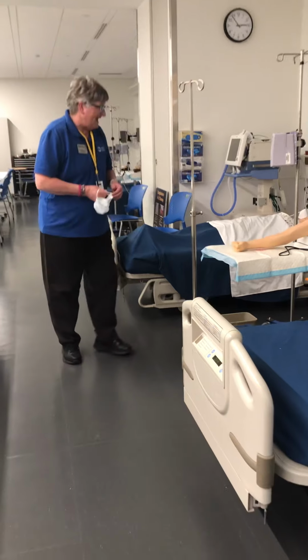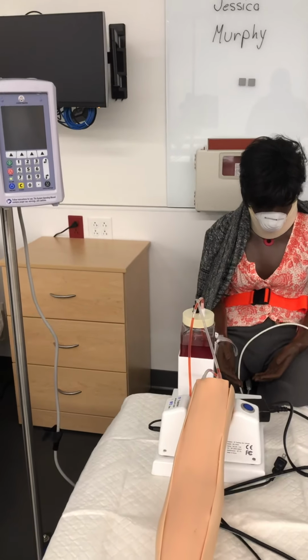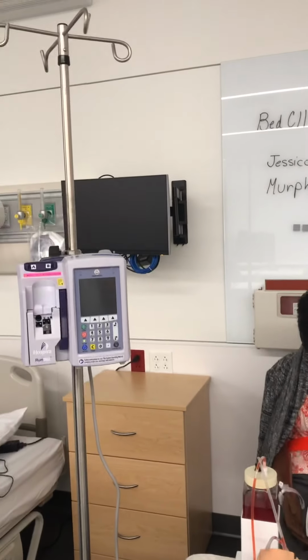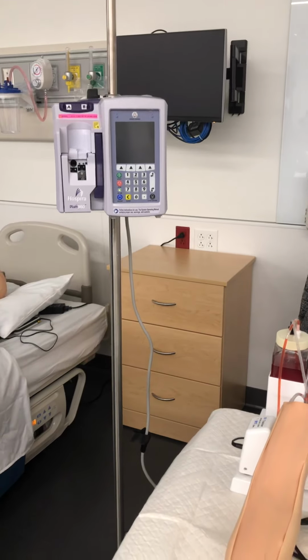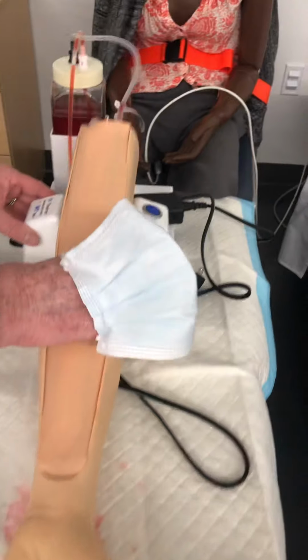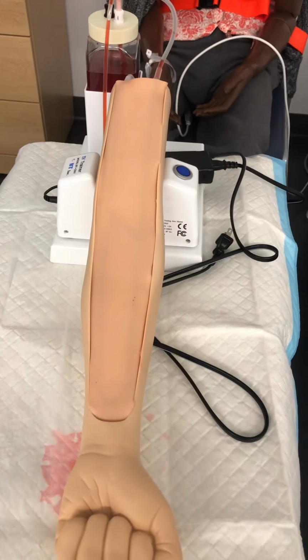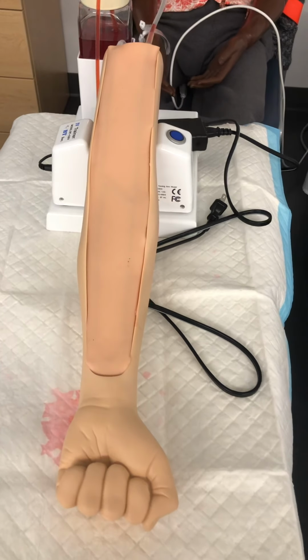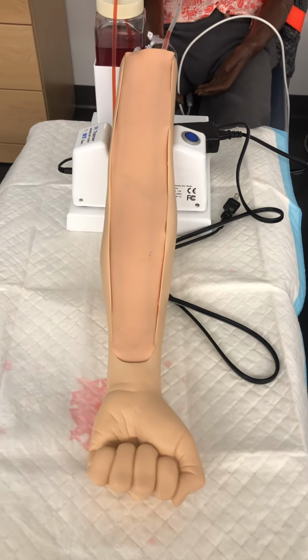The class right now is finishing up learning about how to start IVs and how to run fluids and medications into a patient by using an IV, an intravenous. So a needle goes into your vein, and then fluid can be administered, medication can be administered in that. And what we have here is really simulated blood, so that when you start the IV, you would get blood coming back in that needle, a flashback it's called, and that's how you know that you're in the appropriate place to be able to give them the fluid or the medication.